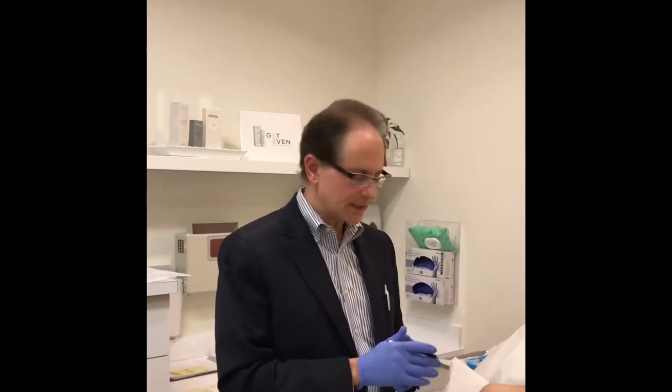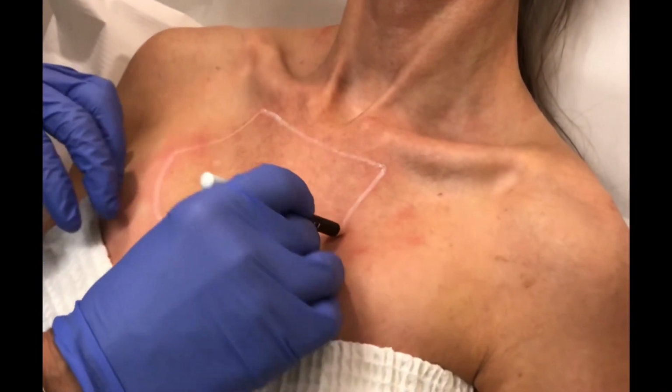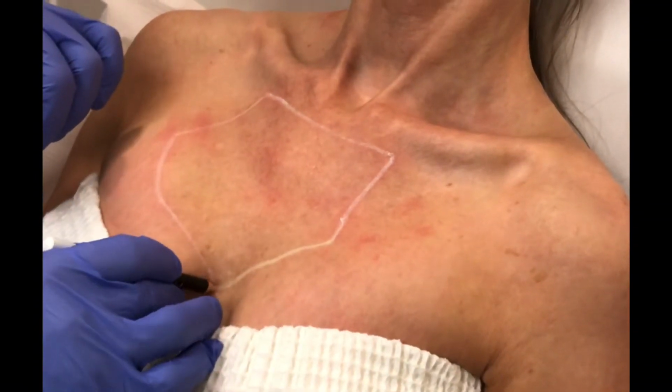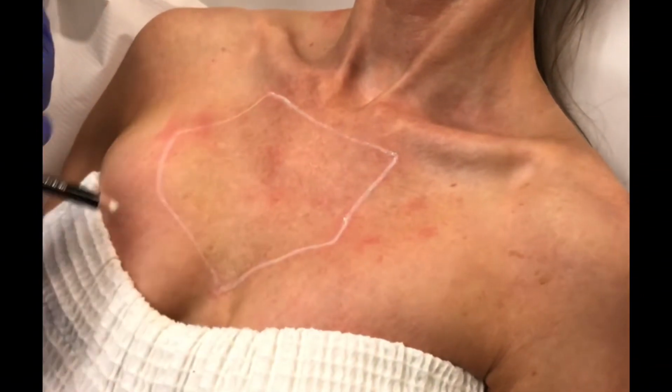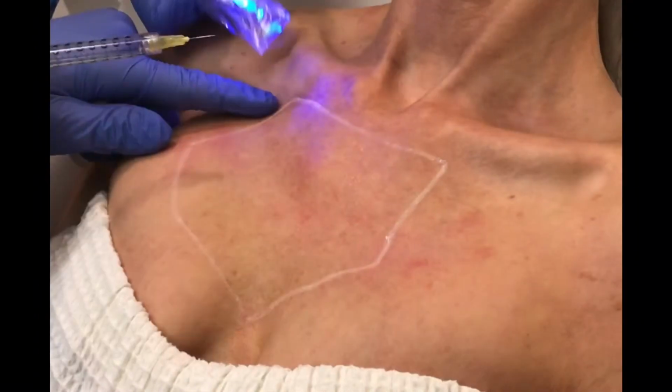And I'm going to draw a template of the area that we're going to work on reducing that crepiness. Sculptra is very exciting because as a filler, it volumizes and it lifts. And studies done in the dermatology literature have demonstrated that it can last as long as 25 months. So it makes it a very ideal volumizer in the skin.